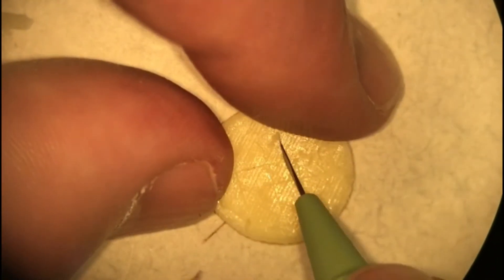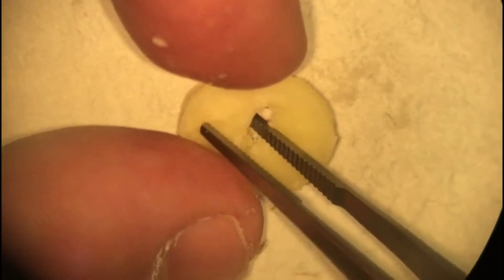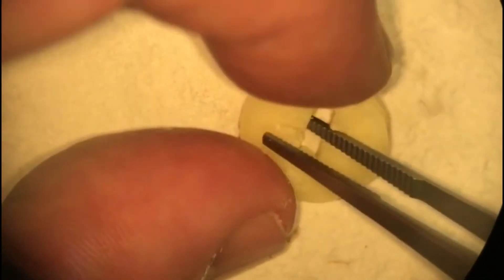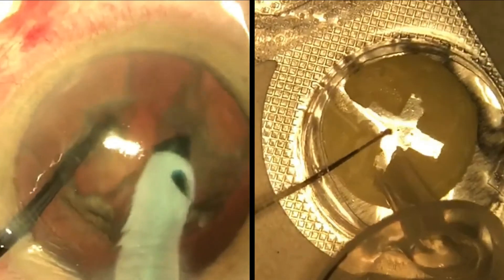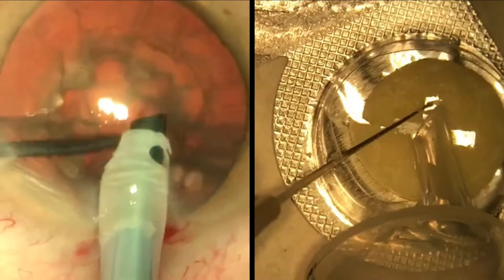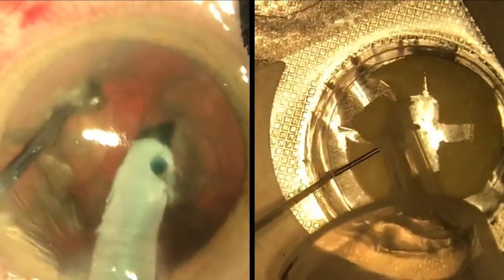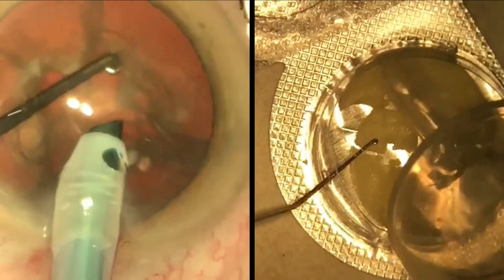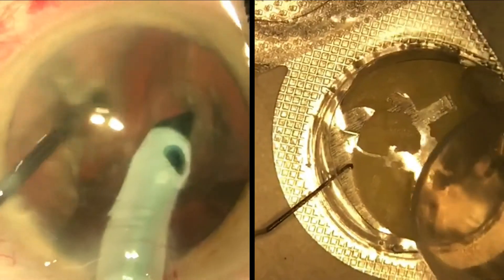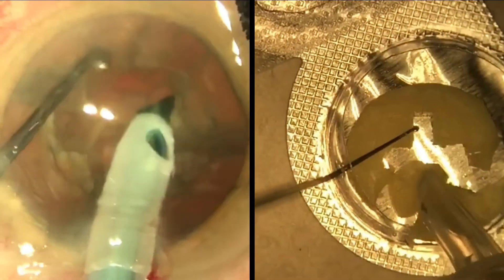Using a slit blade, we carved the shape of a cross in a cheese disc similar to the one used in the sculpting stage to prepare it for cracking. Once again, using the second instrument and syringe as our phaco probe, we performed cracking by aligning these instruments within the groove and applied gentle force horizontally against the side wall of the cheese disc in opposite directions. Note that the second instrument pivots at its entry site.